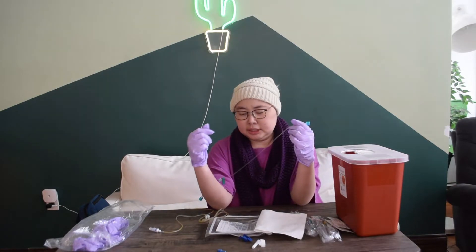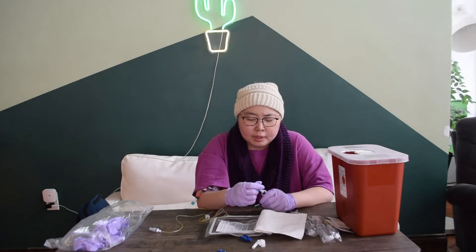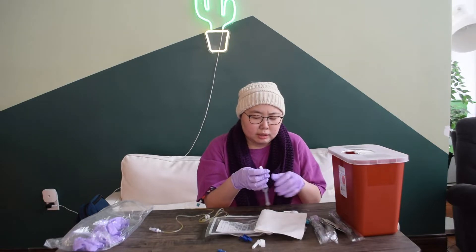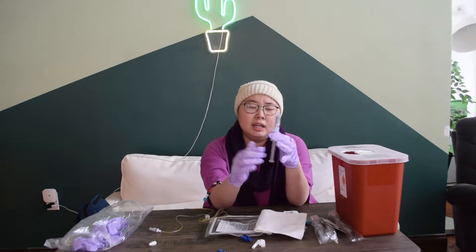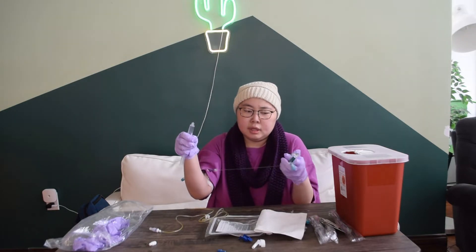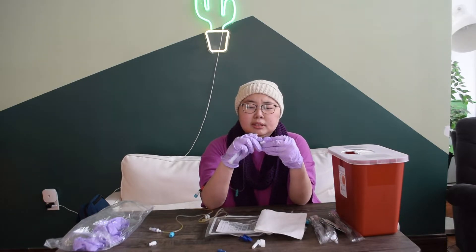I used to not use these long extensions — usually my PICC line kind of stops here — but the extension makes it so much easier. Usually both lines have extensions, but we just needed to order more, so now I only have one. Before I start, I'm going to open everything up and get it all out of the way. When it comes to saline, they also have air in them, so you want to push a little out to get the air out — which always makes a mess. I have my alcohol pad ready. The hospital now uses these nice caps which come pre-saturated with alcohol, so your PICC line should already be clean, but it's always good practice to wipe it off with the alcohol pad first. The instructions say at least 10 seconds.